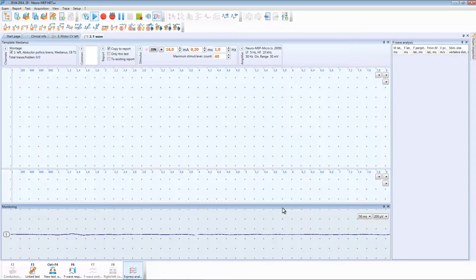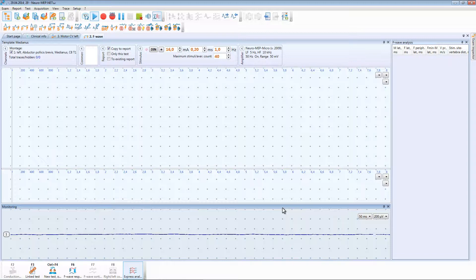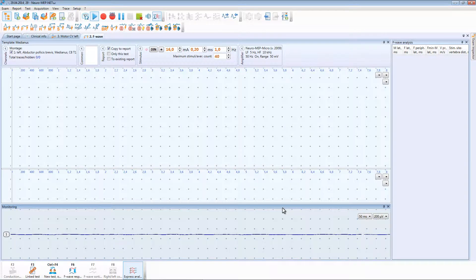Observing the trace in the monitoring window we can make sure that there is no any noise or artifacts. It means that the muscle is relaxed. After that we can close this window.